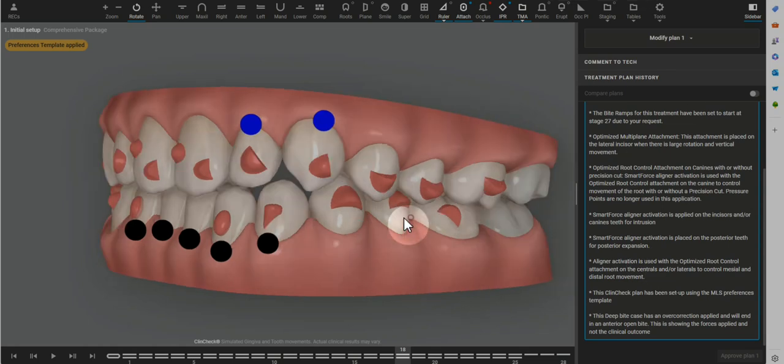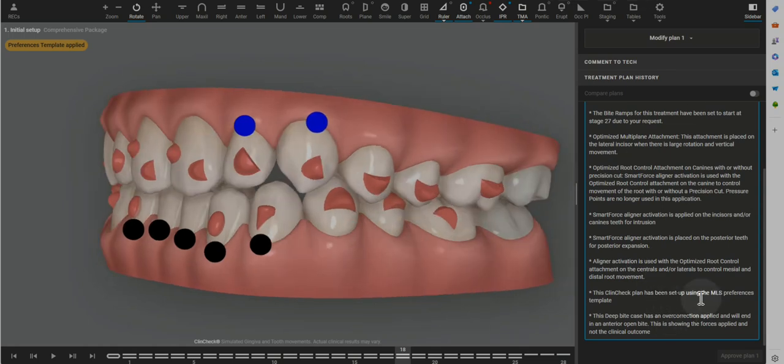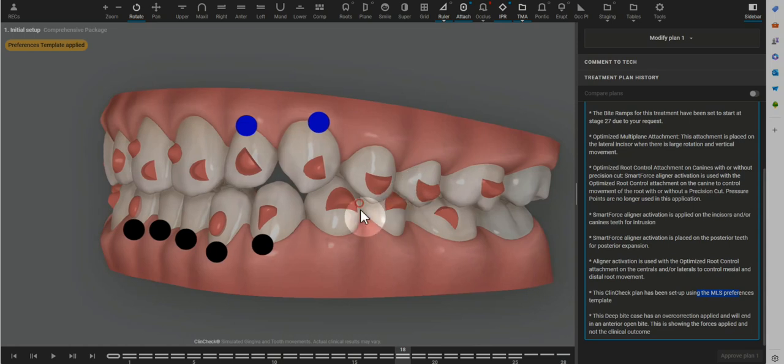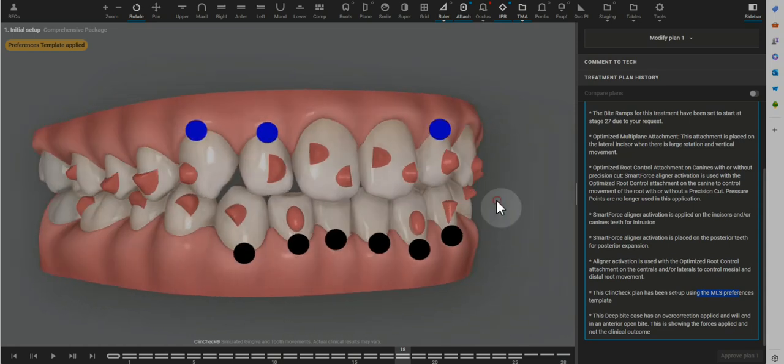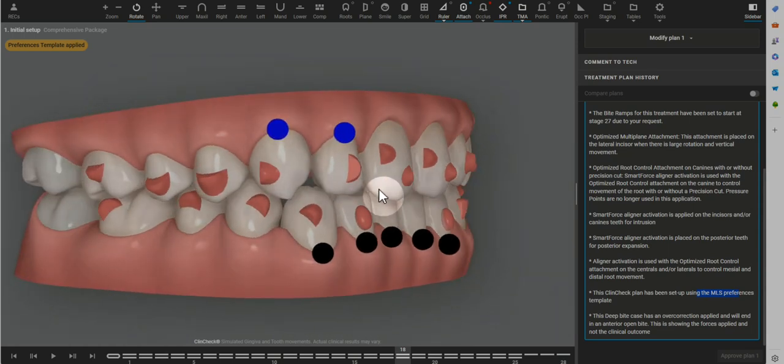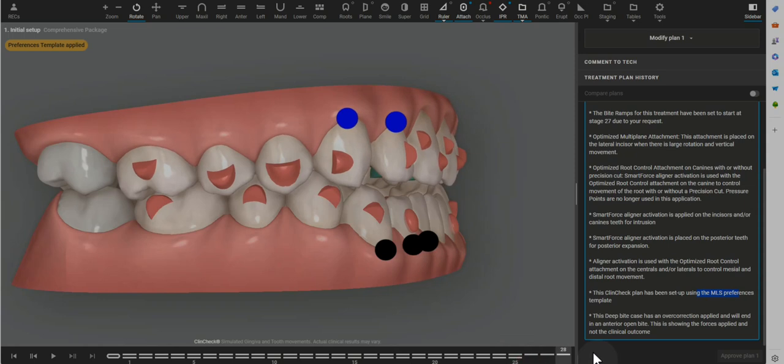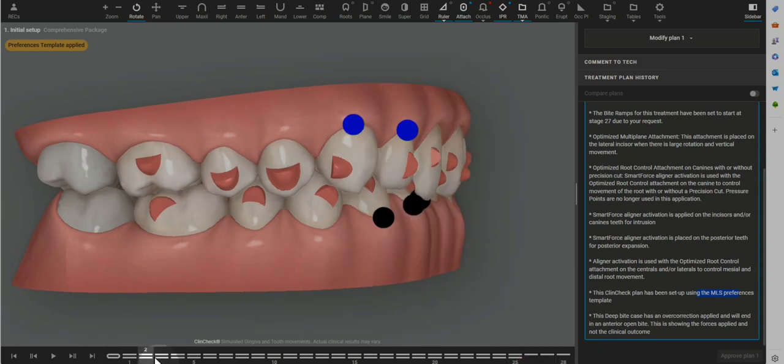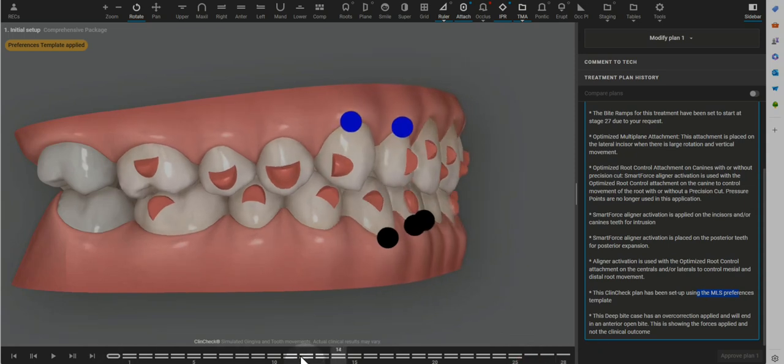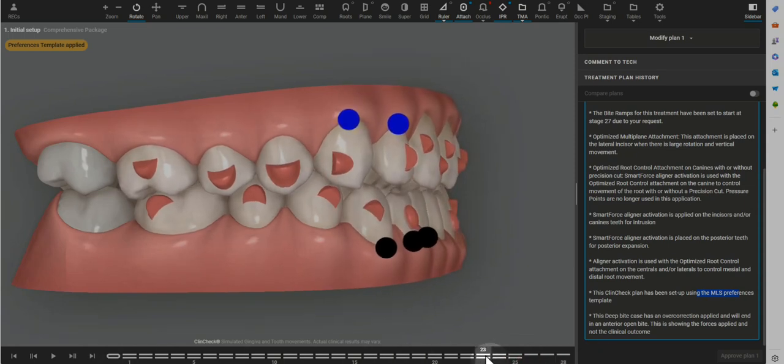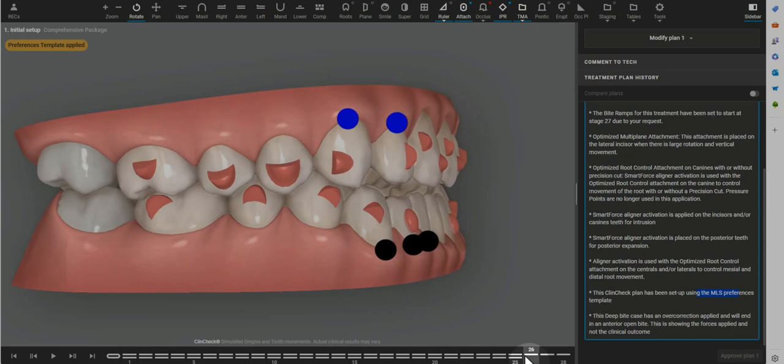Hi doctor. This case is set up with the MLS preferences, which does have a fair amount of differences to the GLR or the ACA essentially template. And there are some things that I do like about the MLS template.